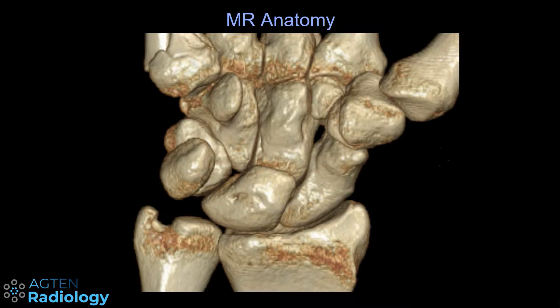The first one I would like to show you is located in this region and it's called the os centrale carpi. It can make a clicking noise in the wrist and sometimes needs to be removed.